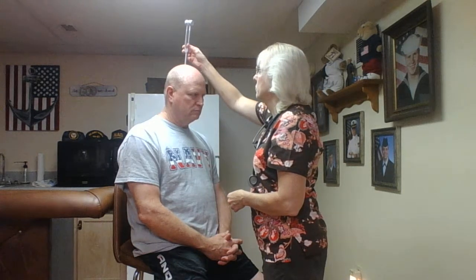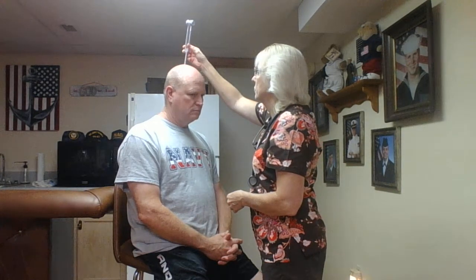So now we're going to test your hearing. And that is the acoustic nerve, cranial nerve number 8. So the first test that we're going to do is the Weber test. What I'm going to do is cause this to vibrate, and then I'm going to be placing it on top of your head. I need you to tell me whether you hear the sound better in the left ear, the right ear, or equally in both ears. Okay? Equally in both. Okay, good.